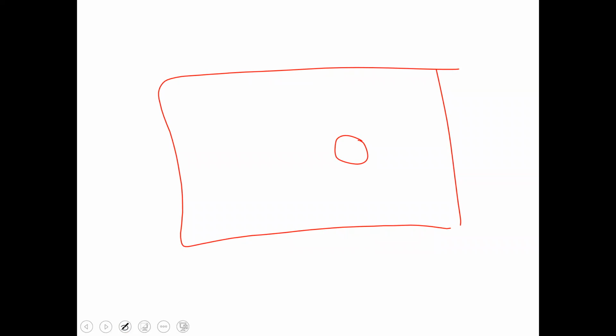And often, if this is the adjacent stroma, okay, let's call this stroma, often you can get retraction of the tumor away from the stroma, okay? And that'll create like a space. And that space can mimic what appears to be lymphovascular invasion. But really, it's not lymphovascular invasion. It's just a separation of the tumor from the stroma, what we call retraction, making it look like the tumor is actually present in a circular space.